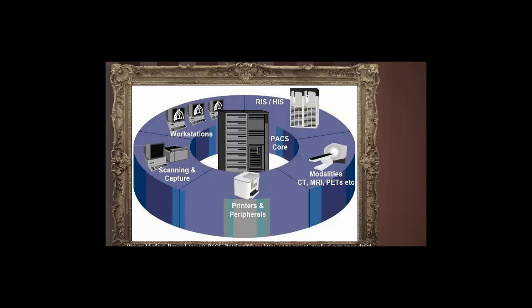Some of our referring doctors who refer to us a lot, we give them privileges so they can look at their images in their office on our PACS system. We use GE, but there are other vendors, Philips and other big names in medical imaging, that have come up with their own software.